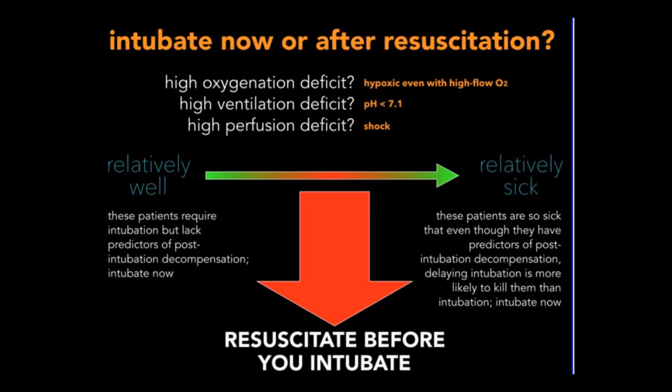Then there are patients who have relatively stable vital signs, reasonable blood pressure, heart rate, and oxygen saturation, reasonable end-tidal CO2. They still need to be intubated. Most of the time, this is your stroke patient, your comatose patient, but they have the ability to wait for you to do the full preparation checklist, and this is your RSI patient. This is the mainstay of the patient that you're taking care of in EMS.